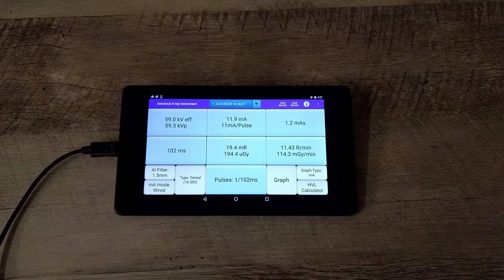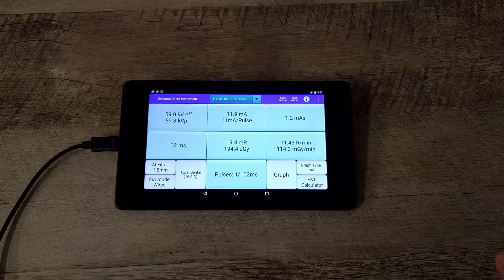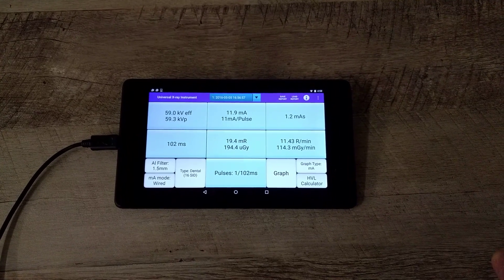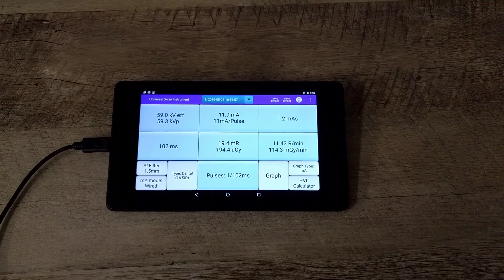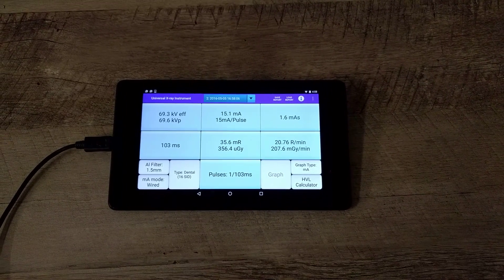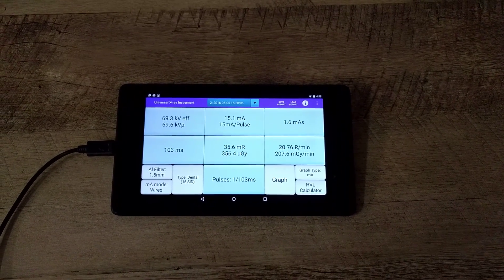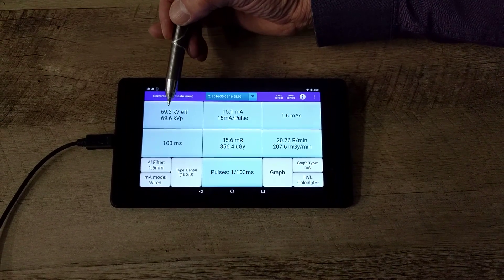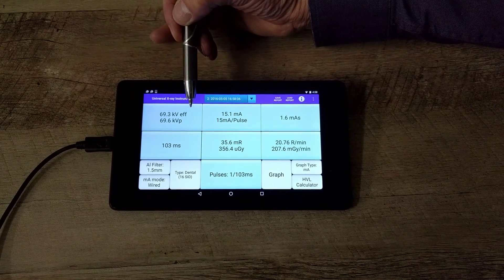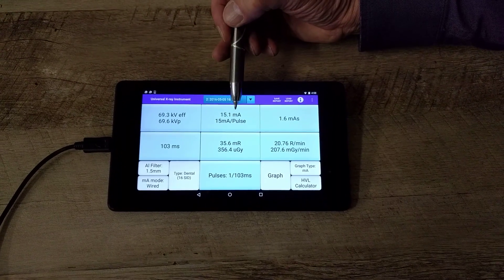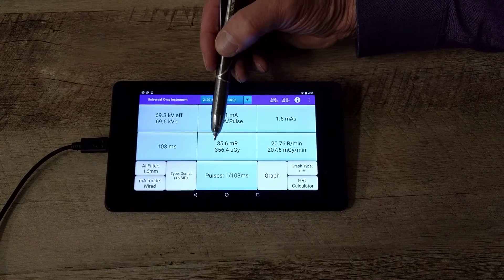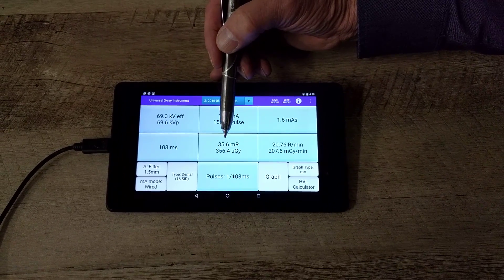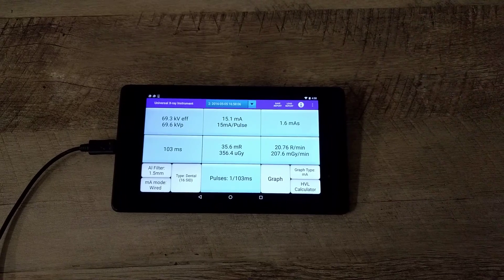I'll give it a little more current and I'll move it up to 70 kV. Take another exposure. You can see that at 70 kV we're reading 69.3 effective and 69.6 peak, and milliamps are higher. Of course your dose is higher, you have a higher kV and higher MA.